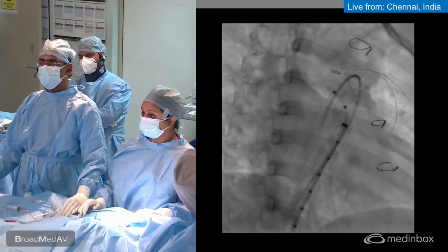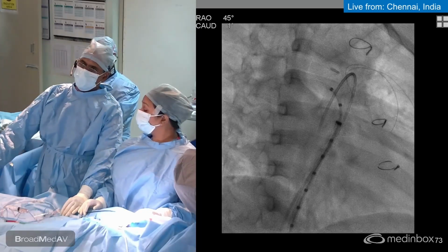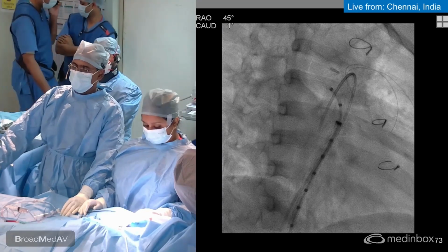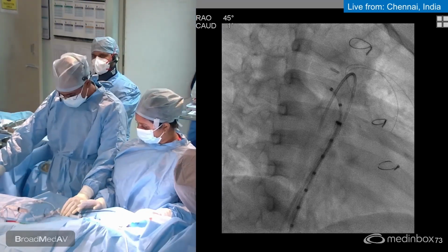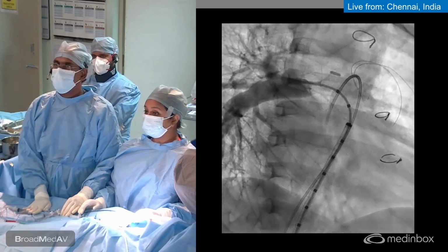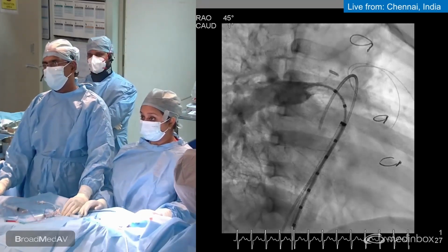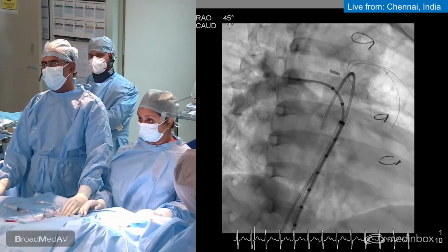Let's see this picture for the right. We will measure the right, and then we will probably introduce this marker pigtail onto the left and make another angiogram. Are we ready for the angiogram? 15 ml at 15 ml per second rate and around 1000 psi. Ready? So it's quite a significant narrowing, and we can find that a lot of the contrast is actually going distally.